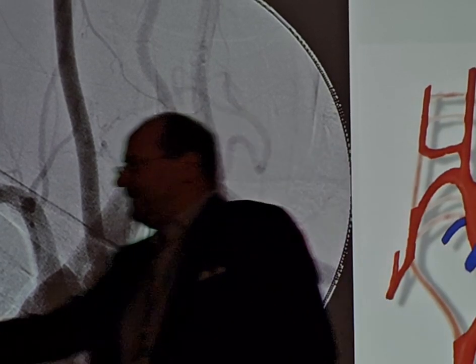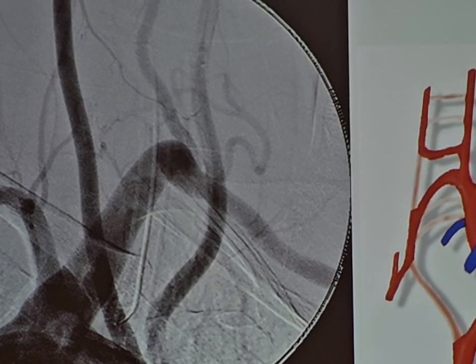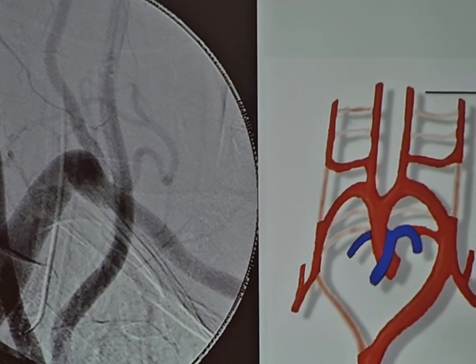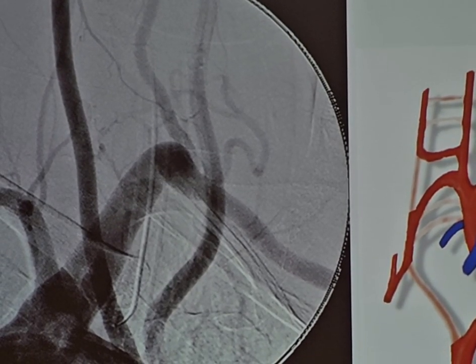Yeah. So Timo's going to speak about this, and that's why I'm not going to go into too much detail. But there are lots of variables for injecting fluid: the rate of flow, the size of the catheter, the patient's blood pressure. Those are all things that determine the concentration of fluid that you're going to use.